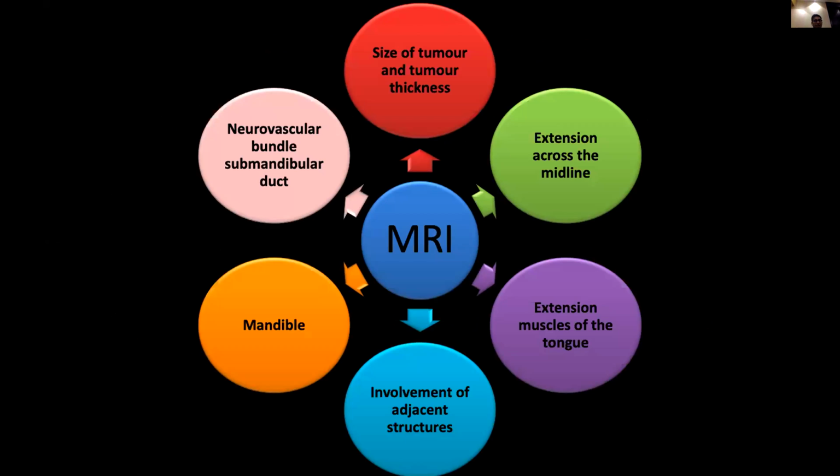You will do the size assessment, the tumor thickness, the depth of invasion. You will assess the extension of the disease across the midline, because if the disease is crossing the midline, that means you will have contralateral nodal disease.